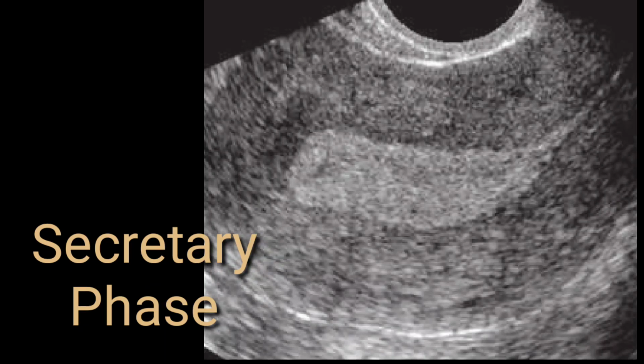Here again on this transvaginal scan, you can appreciate quite a thick and echogenic endometrium. This uterus is anteverted and anteflexed. There is no abnormality in the position. Myometrium is absolutely fine, but you can appreciate thickened endometrium. As I mentioned earlier, you need to have the LMP of the patient on record, so that one can correlate or compare with the radiological proliferation of the endometrium and also the physiological pattern of the menstrual cycle. So that's why it's very important.